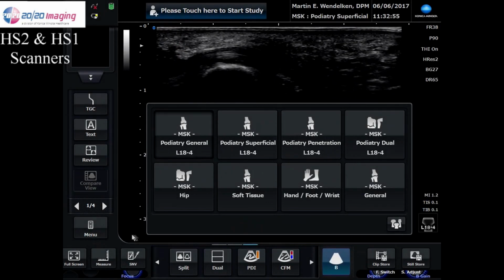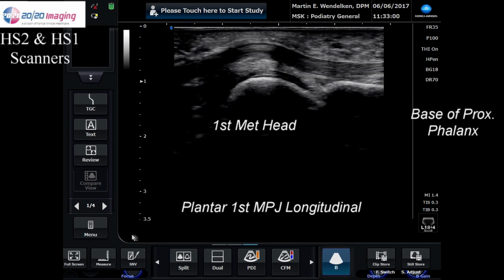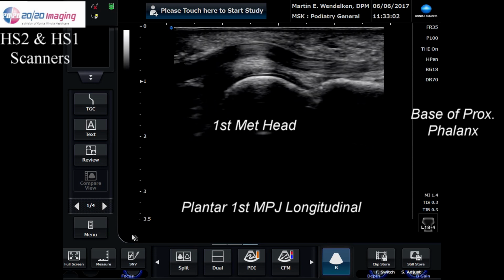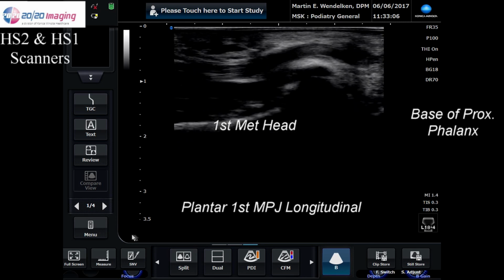Let's now move the probe to the plantar aspect of the foot. But the first thing I need to do is change the settings. So what I did there is I have my presets, and I just basically told the machine to go a little bit deeper and a little bit more power to get through the plantar aspect of the foot.